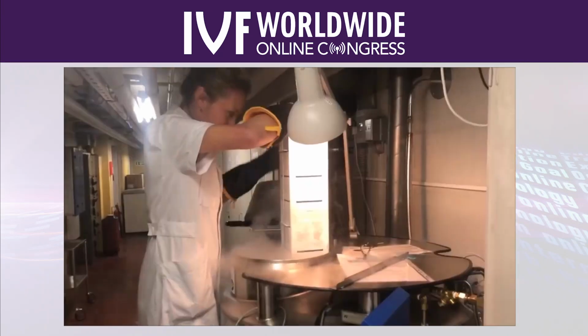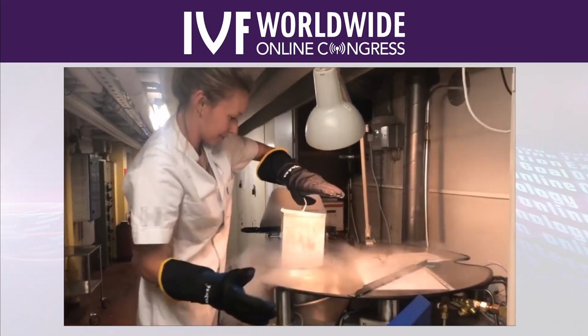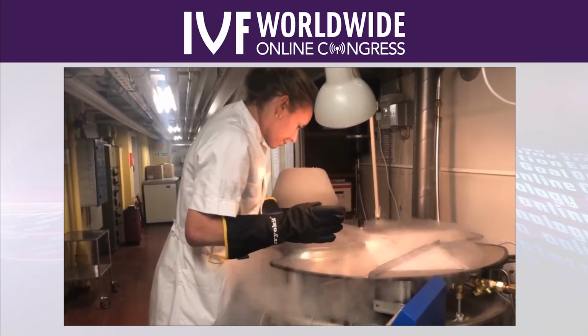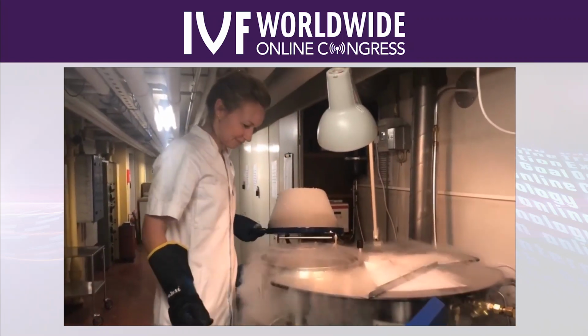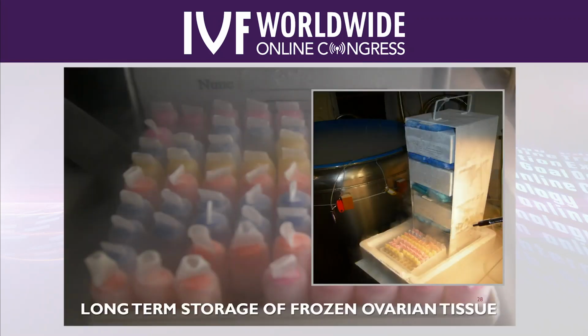And then the rack is going back into storage. So then the tissue is left for long-term storage, and there's actually no limit for the storage time in Denmark. And because some of them are little girls, the tissue might be lying there for 20 to 30 years.